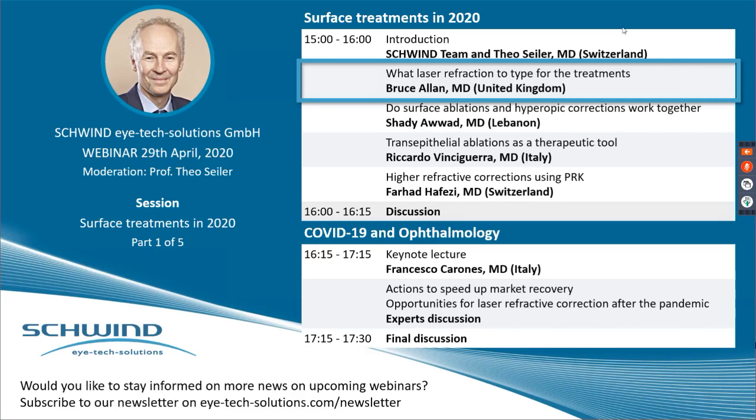Excellent question. Right now, all the previous versions of the system only consider the anterior corneal surface for deriving the corneal wavefront. We are more and more thinking of using the total cornea, so anterior and posterior, but so far it's not released yet. There were a few reasons for that, but as long as the devices are getting better, more accurate, and all the filters have been applied, it makes more and more sense to use the posterior as well. This will make the difference that Bruce was mentioning not disappear, but be reduced definitely.